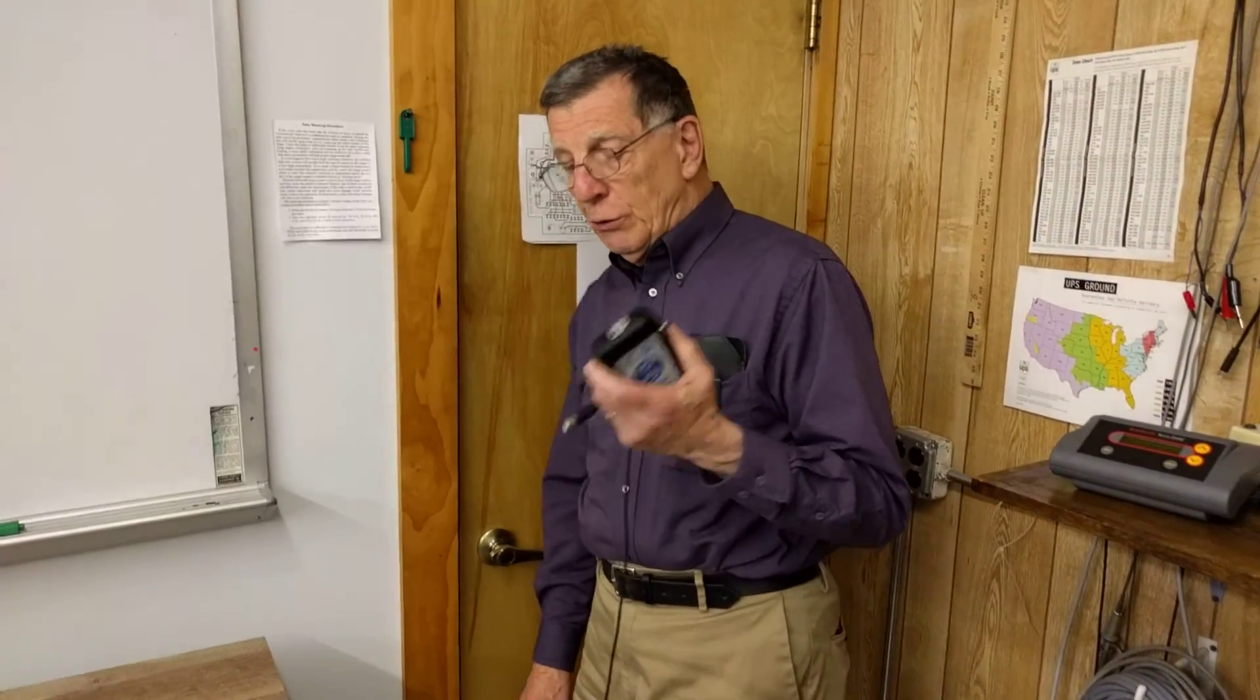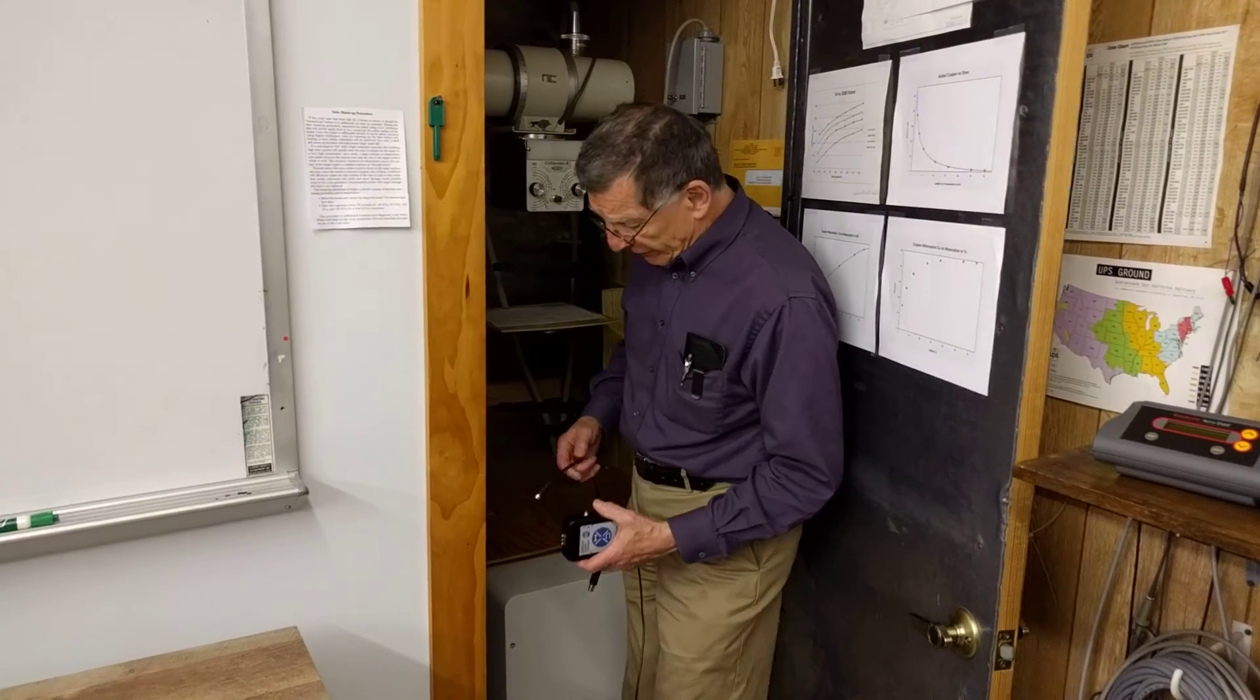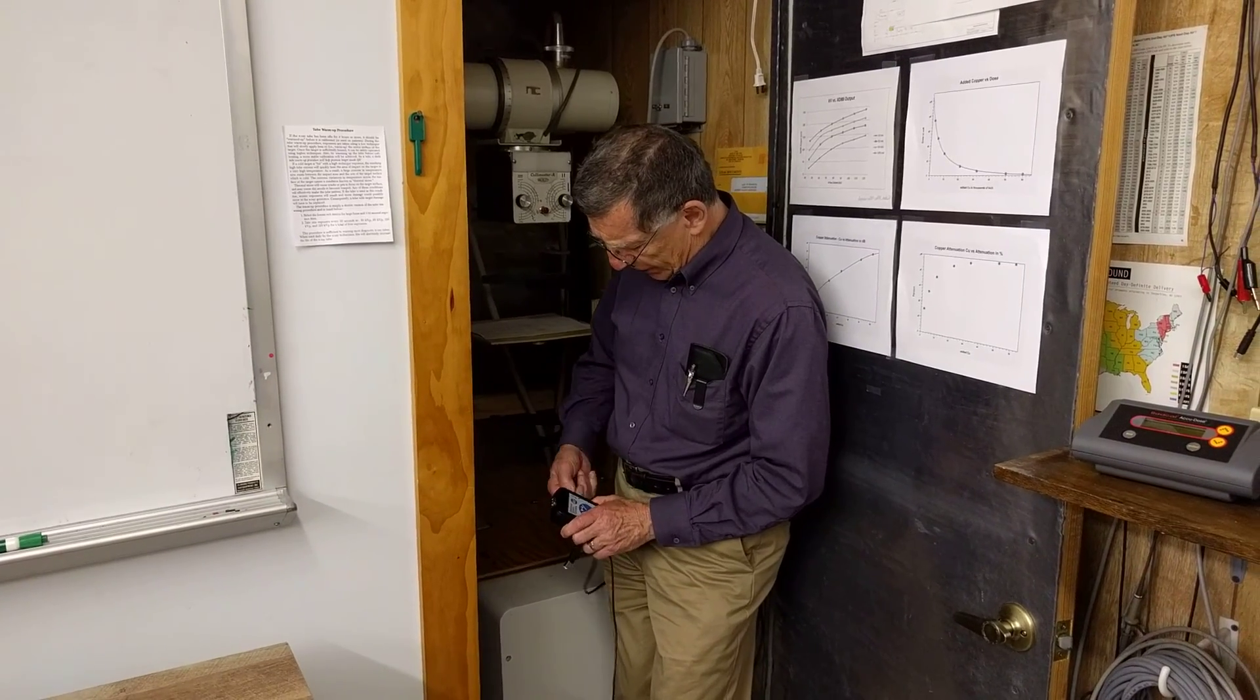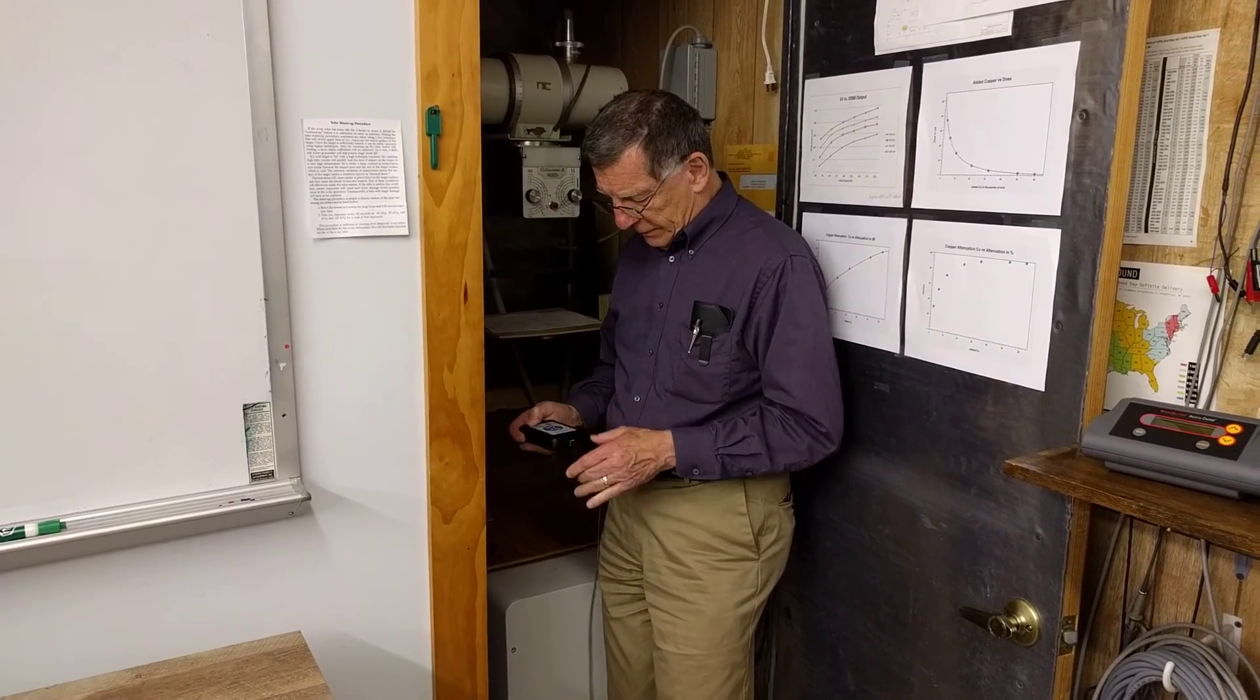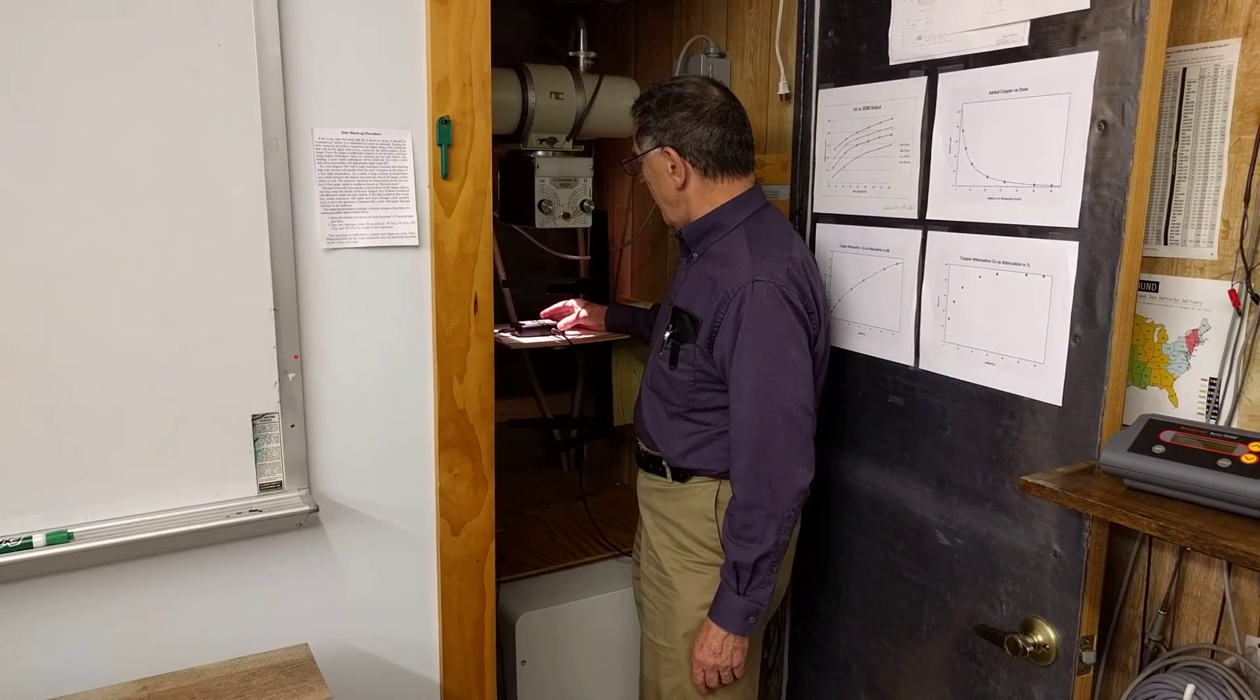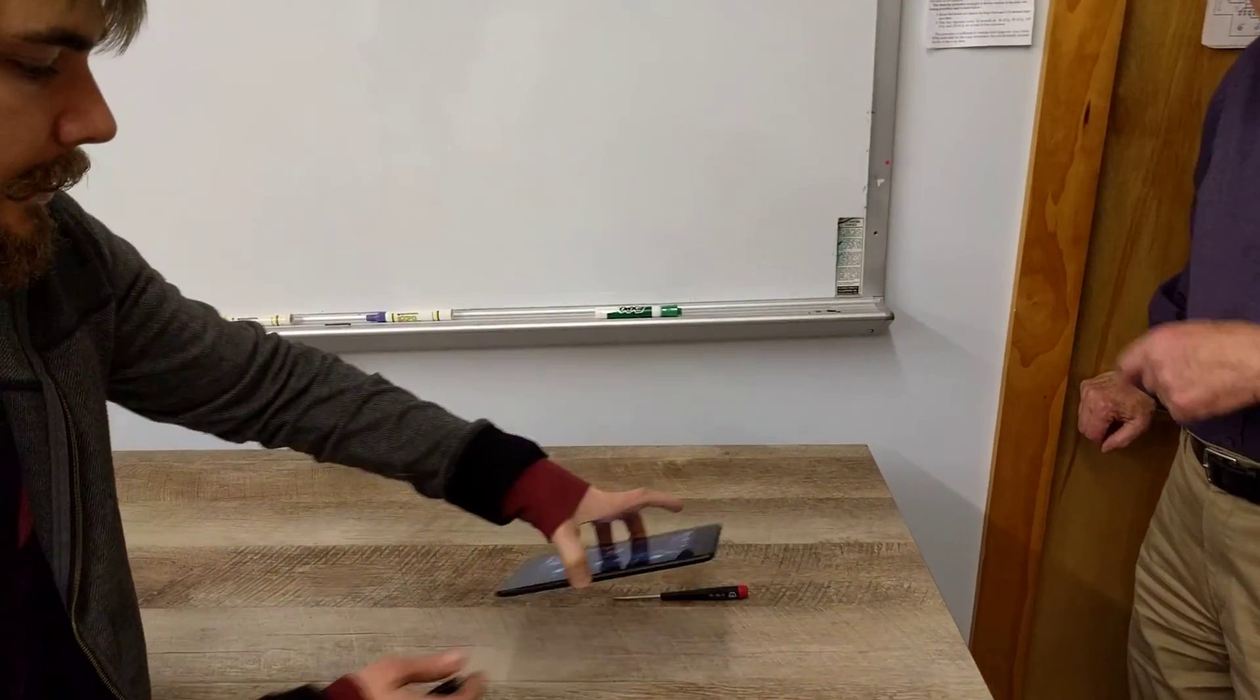Okay, we are going to use the UXI to make some X-ray measurements. You saw in the previous video we connected the MA cable. I will connect that to the X-ray detector unit like so, and this USB Type B gets connected. Center the unit on the X-ray beam and we should be ready to go. Plug the other end of the USB into the tablet.